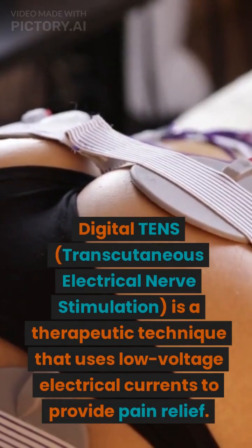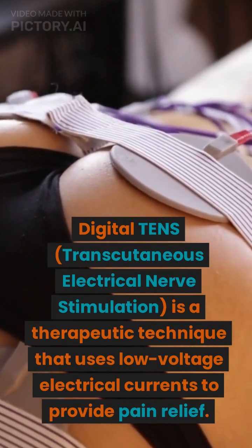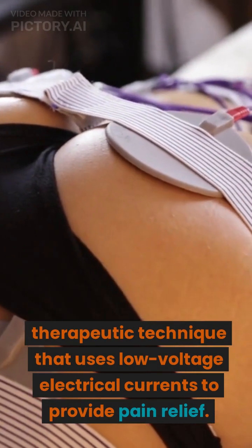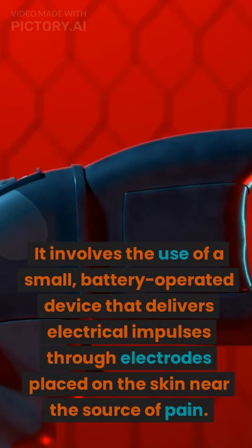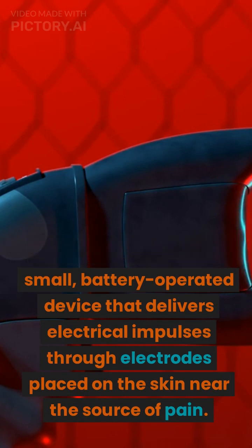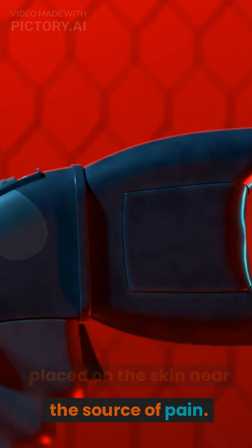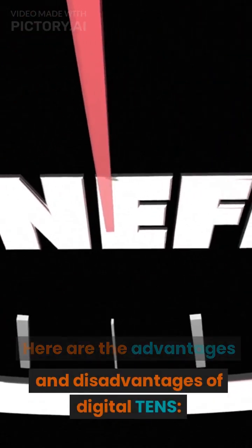Digital TENS, transcutaneous electrical nerve stimulation, is a therapeutic technique that uses low-voltage electrical currents to provide pain relief. It involves the use of a small, battery-operated device that delivers electrical impulses through electrodes placed on the skin near the source of pain. Here are the advantages and disadvantages of digital TENS.